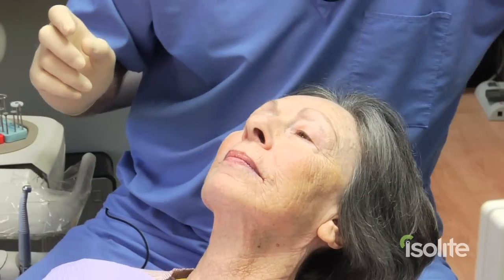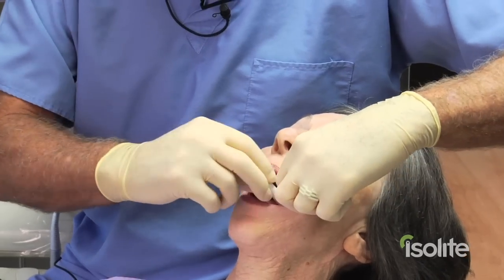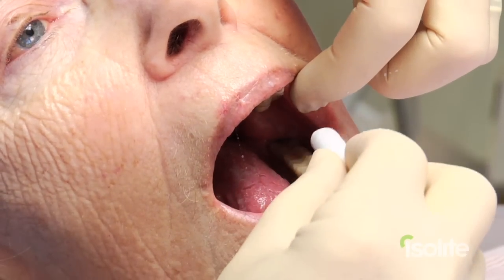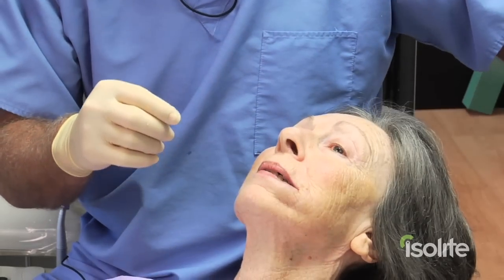We're going to contrast this with cotton roll and dry angle aspiration. Sometimes we don't have the isolate, and we need to isolate with cotton rolls and dry angles. Raise your tongue to the top of your mouth. We can fill our mouth up full of cotton rolls, and we can stick a triangle in here.